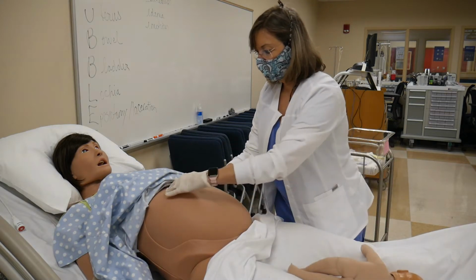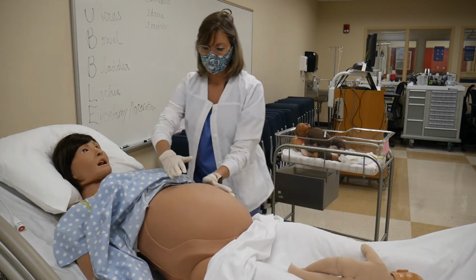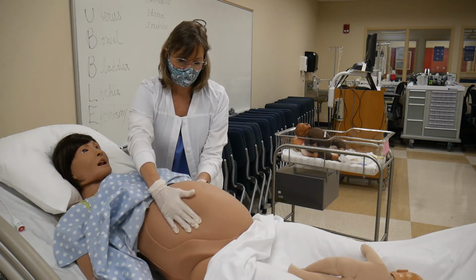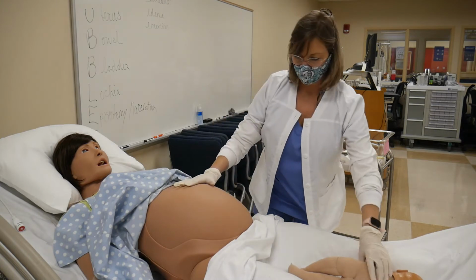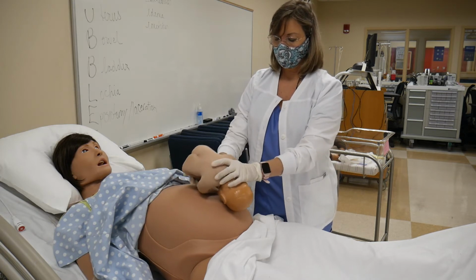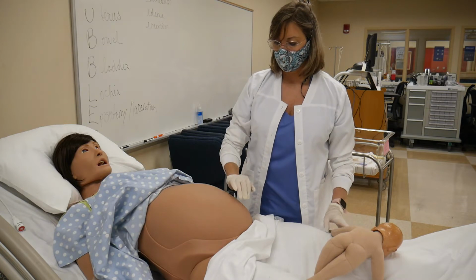So that's going to give you an indication of what position the baby's in. And then you're going to come to the head of the bed, and you're going to feel again in the opposite direction to confirm your findings. So if the baby's in this position, the best place to put the fetal monitor would be mom's right lower quadrant.